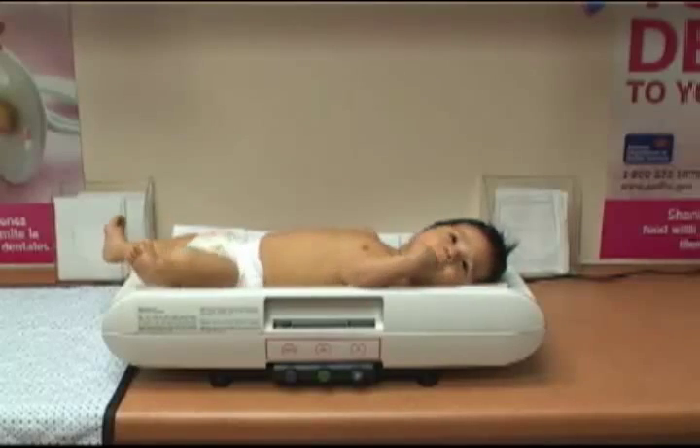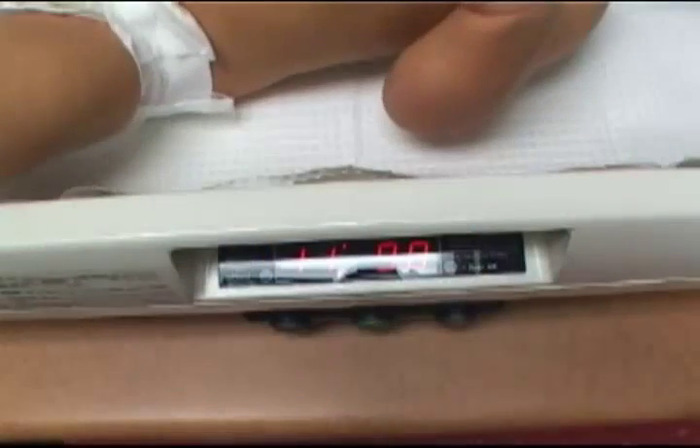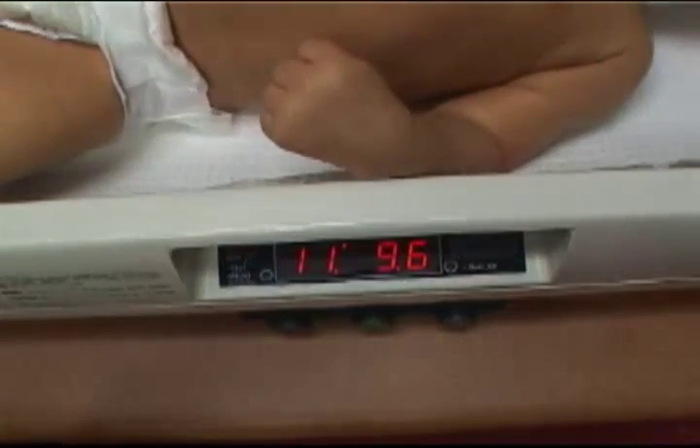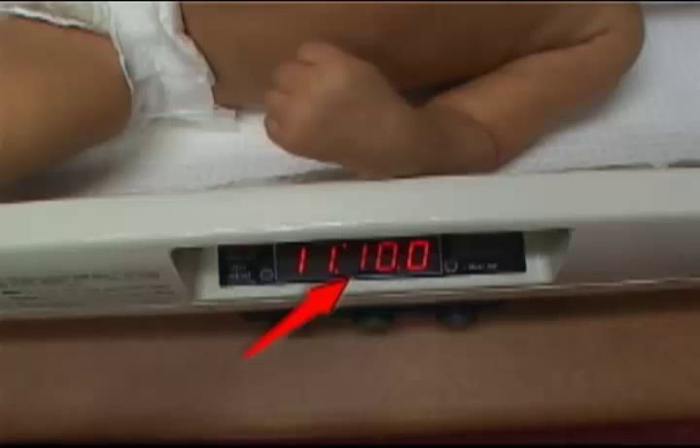Just allow the scale to adjust and stabilize. Most infant digital scales display weight in pounds, ounces, and tenths of an ounce. Record the weight to the nearest ounce. As you can see, this child weighs 11 pounds, 10 ounces.